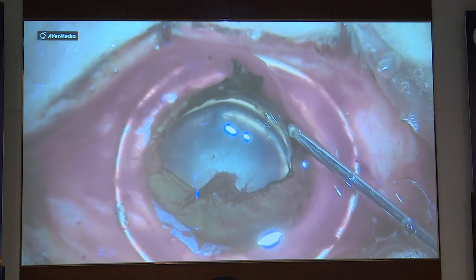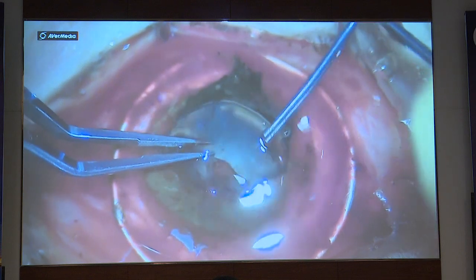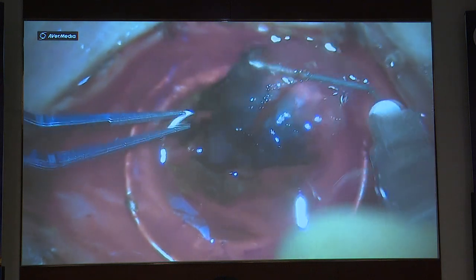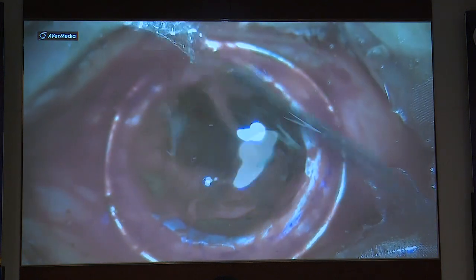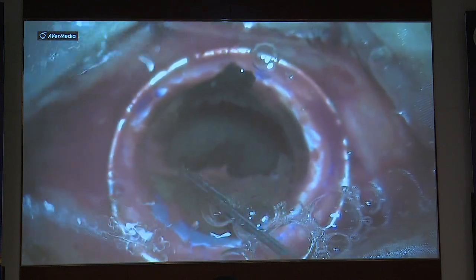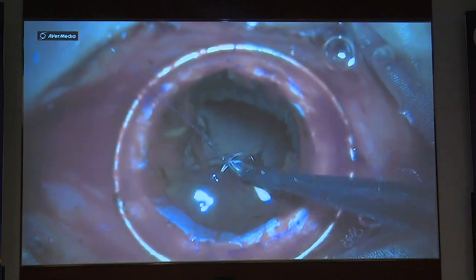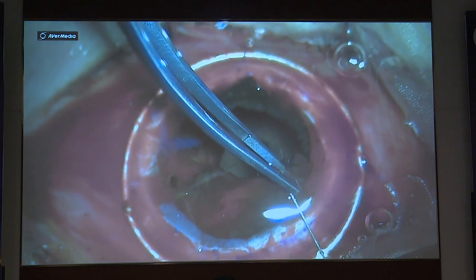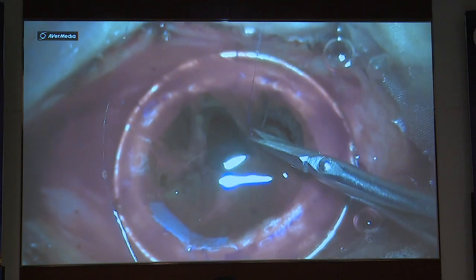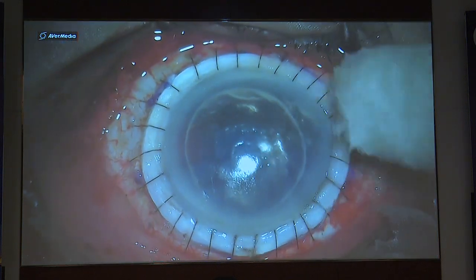Did an anterior vitrectomy inferiorly and tried to dislocate the lens. But superior zonules were pretty much intact. So started a capsulotomy and then eventually removed the nucleus with the bag. Now there was a lot of bleeding and blood clots which were not going with washing. So I used a vitrector and removed all the blood clots. Found iris at the healthiest point and planned to do an iris repair to avoid PAS and further increase of IOP. Did it at 2 places. Completed the anterior vitrectomy and did the suturing.